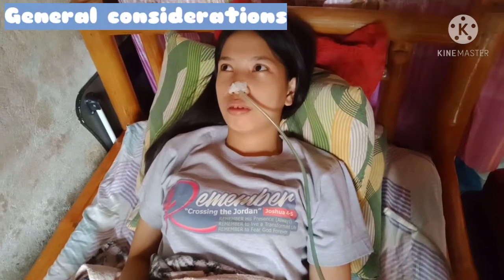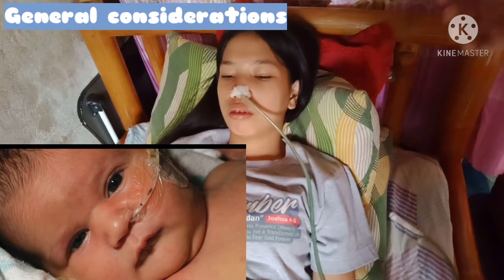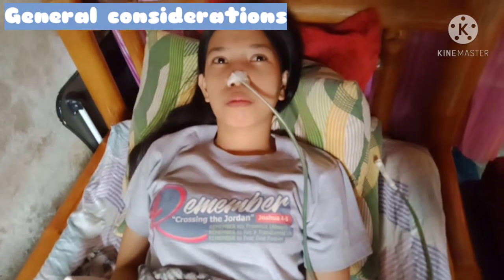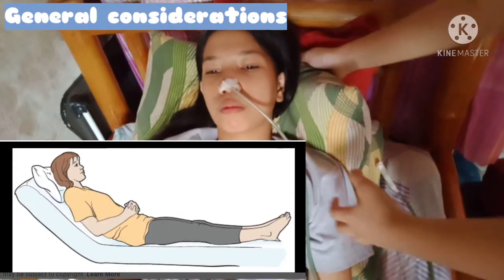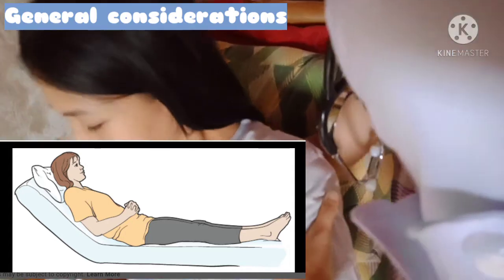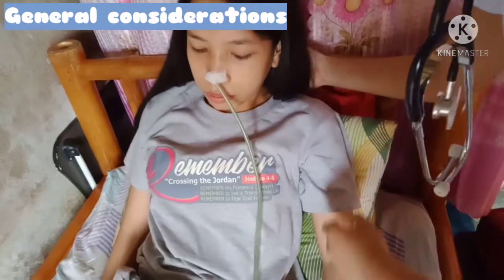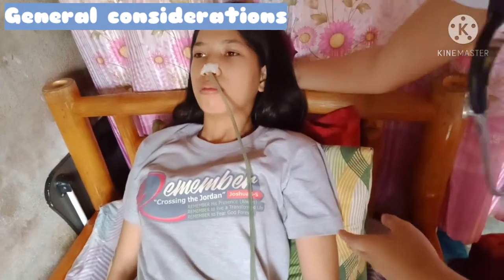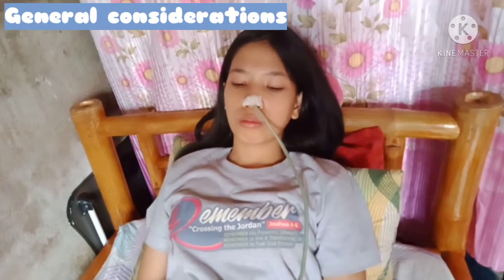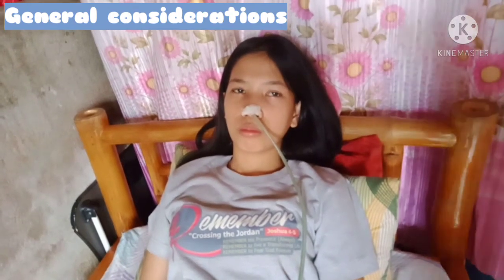For general considerations, first you have to verify tube placement before the feeding and establish patency of the tube. Next, ensure that the client is sitting upright on a chair or in a bed, and infuse the feeding slowly. Next is to report any difficulty in infusing the feeding or any discomfort voiced by the client.